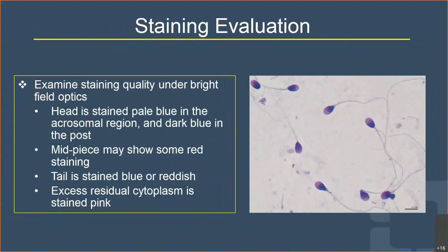Examining staining quality under bright-field optics: the sperm head should be stained pale blue or lavender in the acrosomal region, and should be dark blue or dark lavender in the post-acrosomal region. The midpiece shows some red staining, and excessive residual cytoplasm around the midpiece will also be stained pink. An example from our lab with Diff-Quik staining shows clear demarcation and differentiation of the spermatozoa.